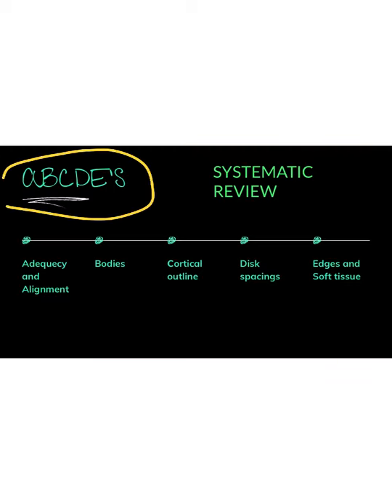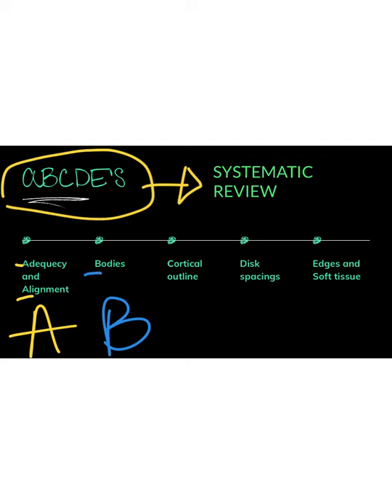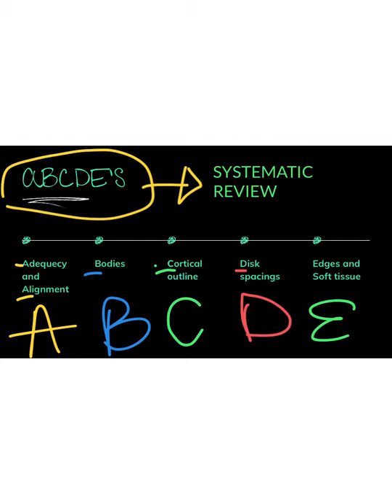We use the ABCDE approach to systematically review our c-spine x-ray. A: Am I adequately seeing all the relevant structures? The second A is alignment — all lines should be uninterrupted within the c-spine x-ray. B: Bodies — we're looking for any deformity in the vertebral bodies. C: Cortical outlines — looking for any fractures. D: Disc spacing — looking for any irregularities indicating herniation. E: Edges and soft tissues — looking for surrounding fractures as well as soft tissue injuries.